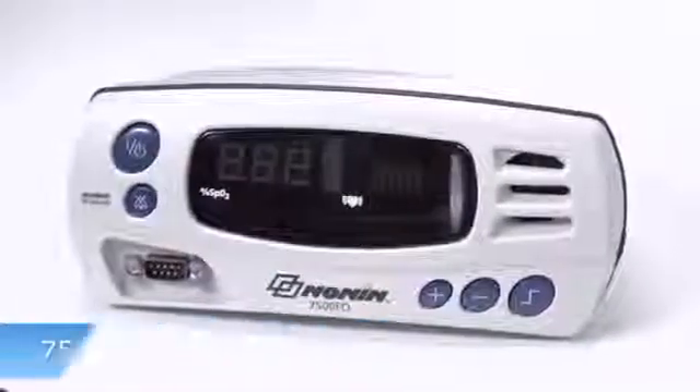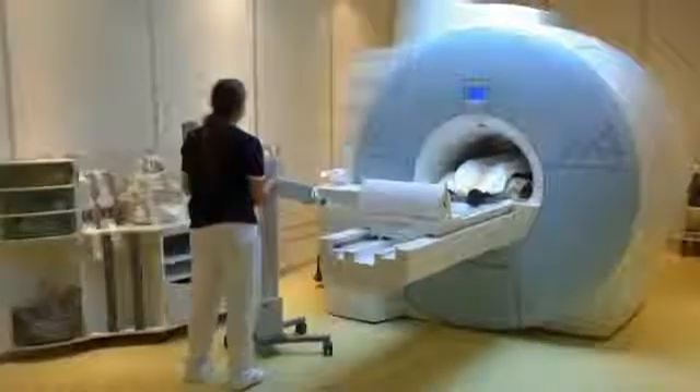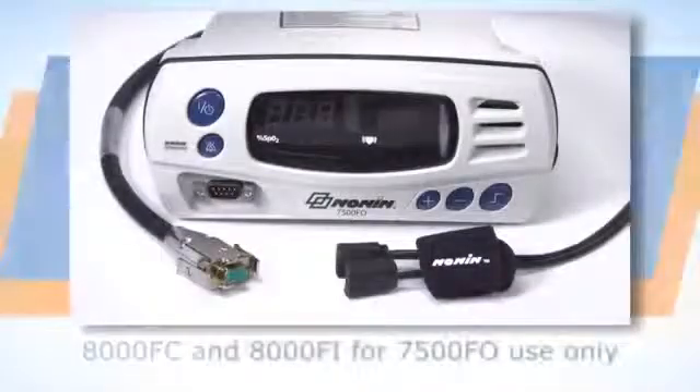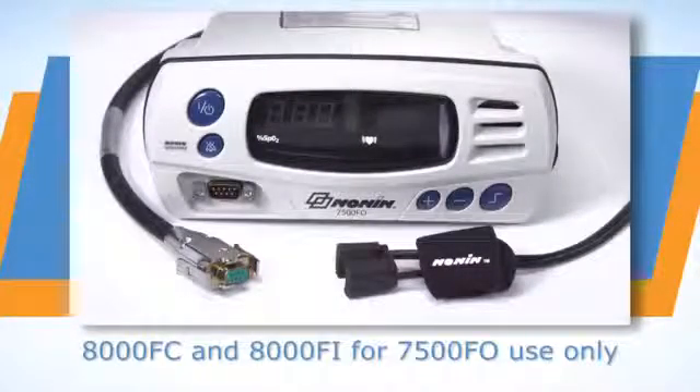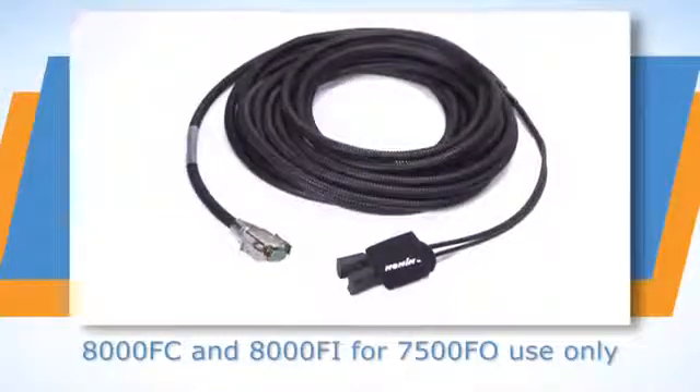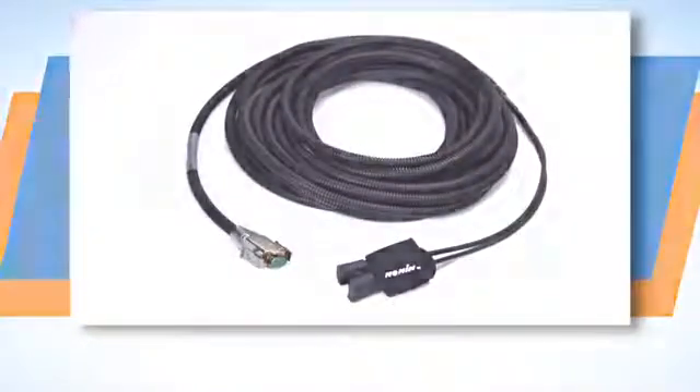The 7500 FO model is specially designed for use in magnetic resonance imaging environments. It has the same functions as the 7500 model, but is configured for use with Nonin 8000 FC or 8000 FI fiber optic sensors only.